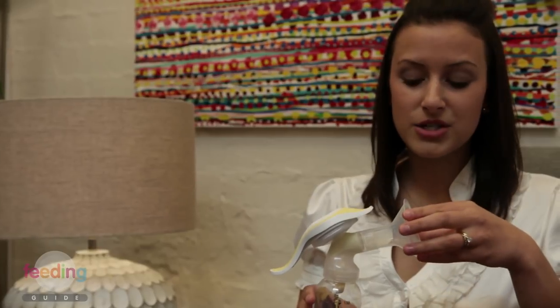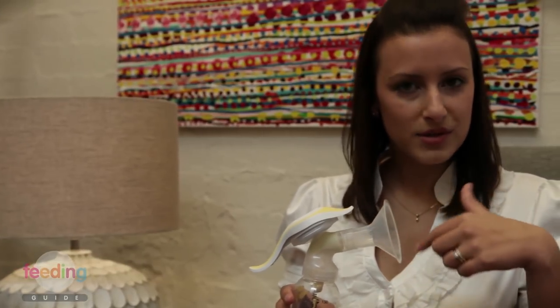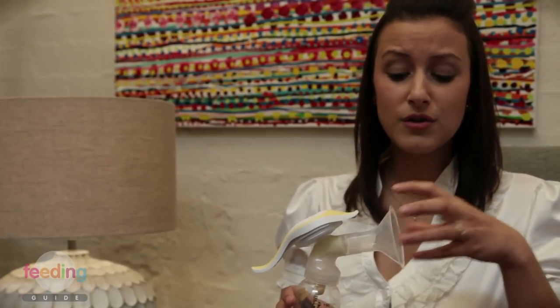I've got a standard size breast shield here today. It is important to have the right size breast shield for you so that you get a good seal, you don't damage your nipple, and you get optimal emptying of the breast.